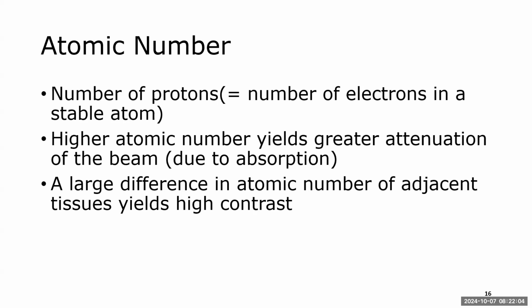So when we look at these three things individually that affect attenuation or affect differential absorption, which affects subject contrast, right? They all sort of affect one another. Atomic number, if you think back, if you had Ethan's class, and you certainly had this information in your prereq courses.